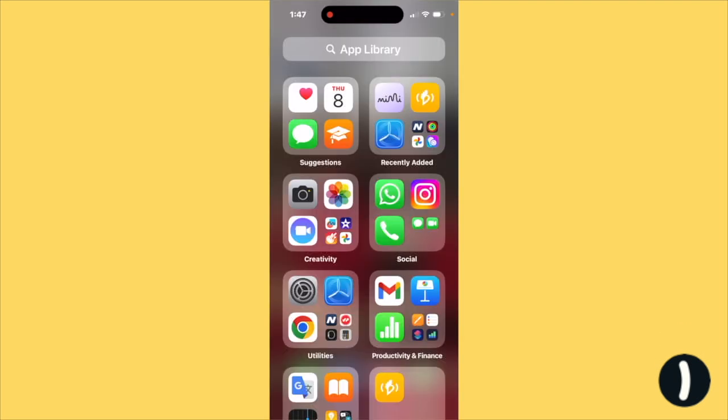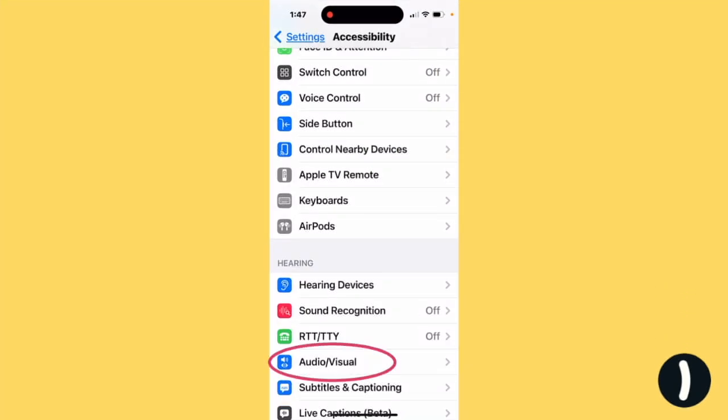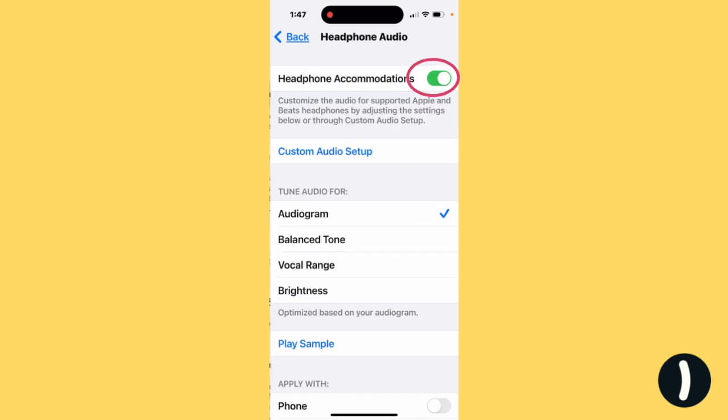You can also do this through Headphone Accommodations in Settings. Tap Accessibility, then Audio-Visual — and not Hearing Devices, that's for hearing aids. Tap Headphone Accommodations. Make sure Headphone Accommodations are enabled, and make sure under Tune Audio For, you've selected Audiogram.